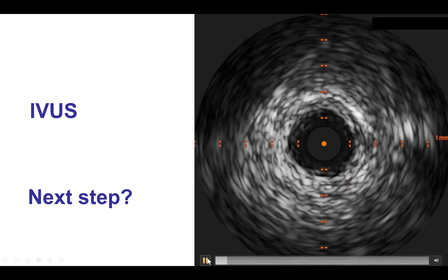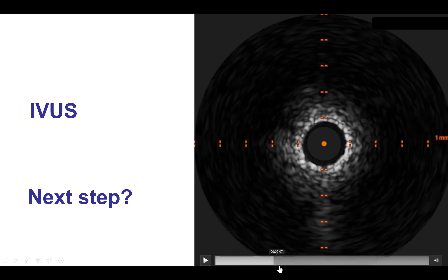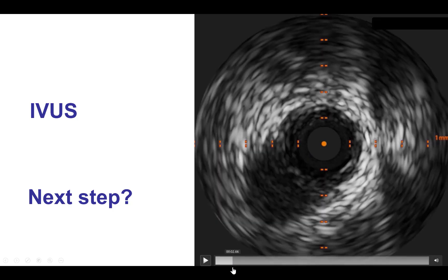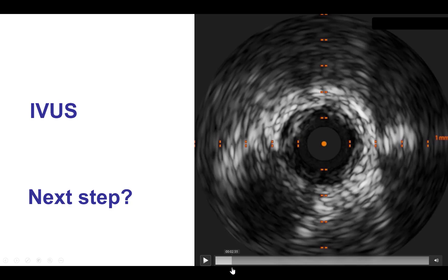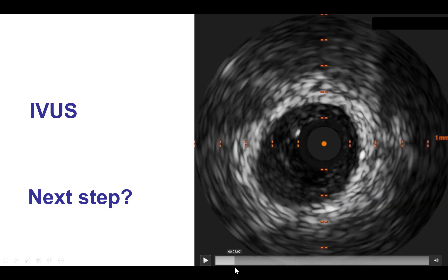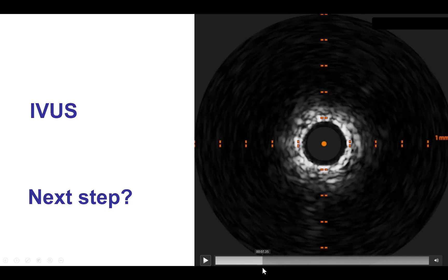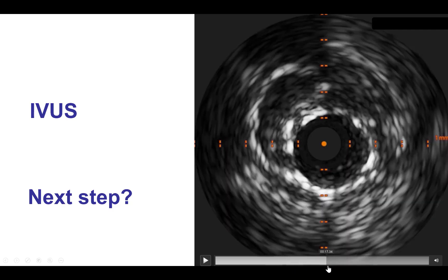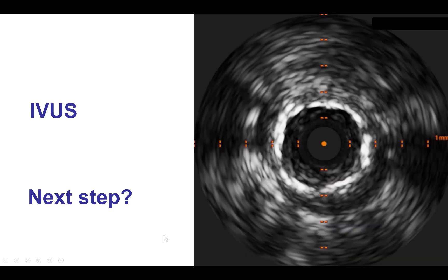We then performed intravascular ultrasound once again, and sure enough, there was still stent under expansion in the distal right coronary artery. This is the distal PDA-PLV bifurcation coming more proximally. There is the stent and there is the area of severe under expansion, which is fairly focal, with the stent more proximally being well expanded.